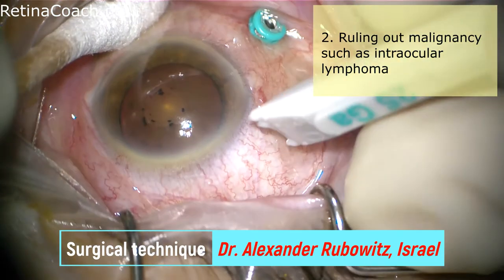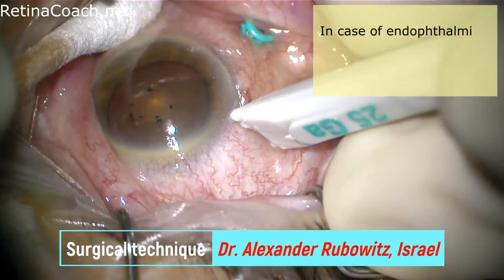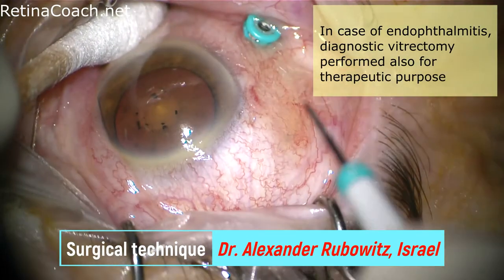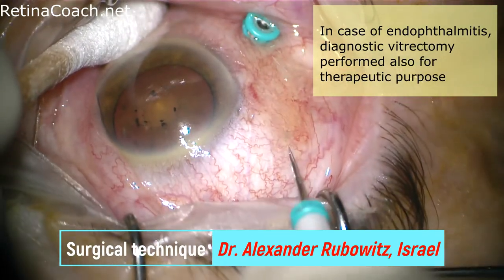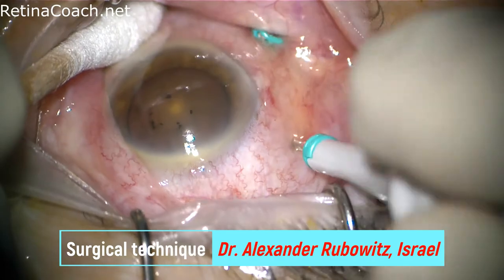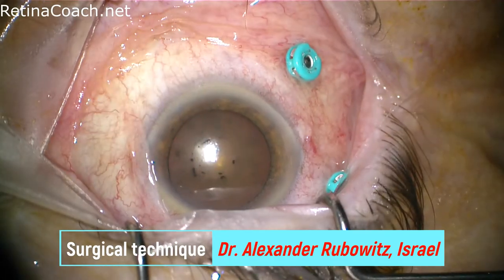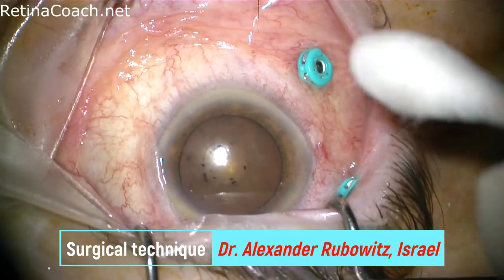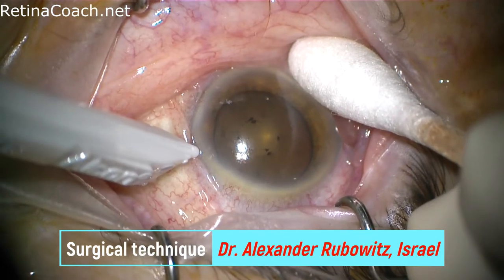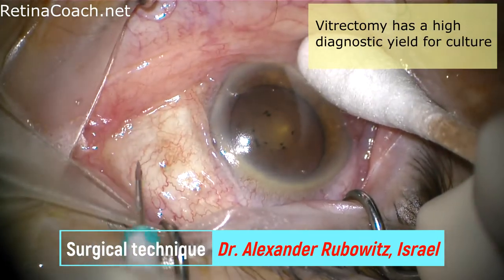In case of endophthalmitis, diagnostic vitrectomy is also performed for therapeutic purpose. It may remove a large number of organisms seeding the vitreous cavity and, as a result, decrease the disease activity. Vitrectomy has a high diagnostic yield for culture.